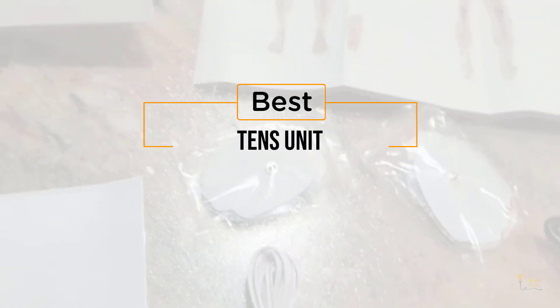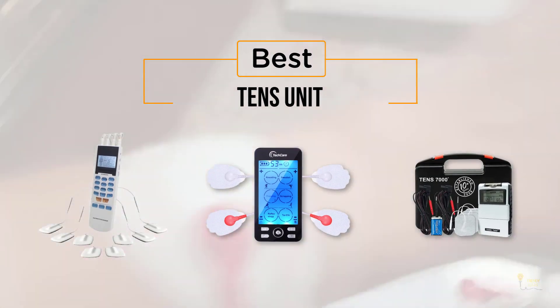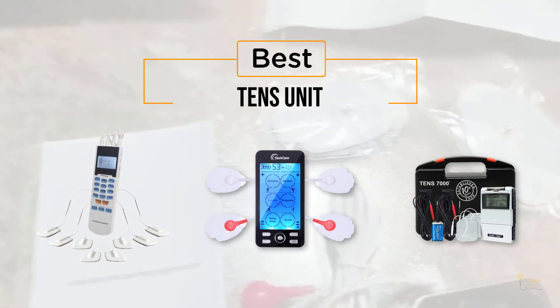If you're looking for the best tens unit, here's a collection you've got to see. Let's get started. At any time you can click the circle for more info and real-time deals.